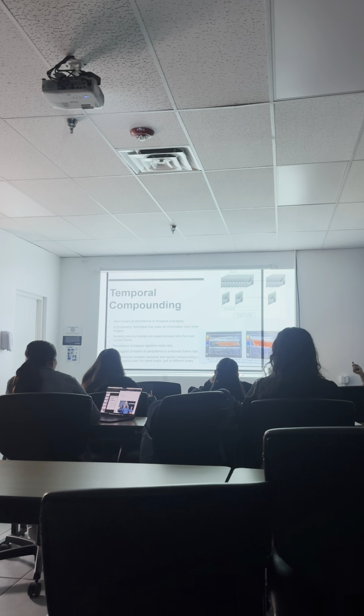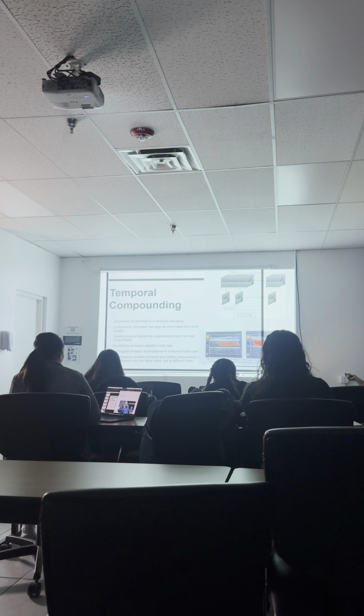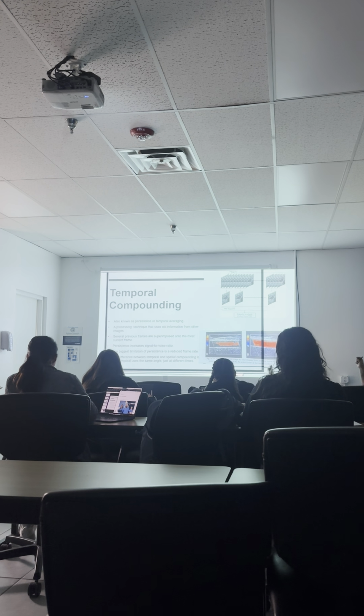Stenosis. Okay, but all we need to do is adjust our settings, and one of the settings that can help us fill the vessel is our persistence. So we can increase the persistence or the temporal compounding, and it will use the Doppler shifts from older images and put them onto the new one to fill up that space.